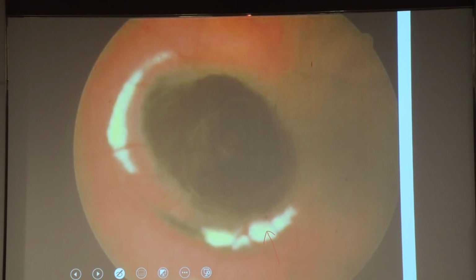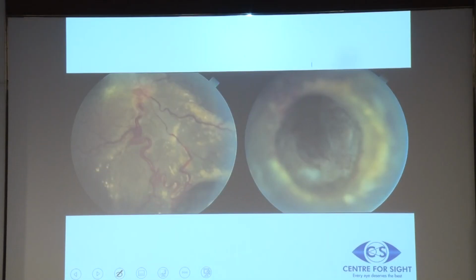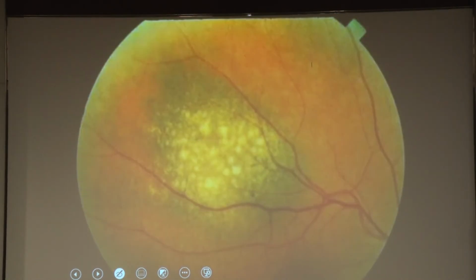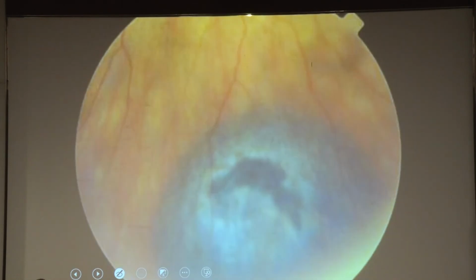Earlier, CHRPE was considered something that never grows, but actually it can grow, it can become an adenoma or even an adenocarcinoma. This was a very florid growth of CHRPE into a retinal pigment epithelial adenocarcinoma. These are rare tumors but can present. Of course, that's an optic nerve head melanocytoma. If you have a pigmented retinal or choroidal lesion, and there are a lot of drusen on top of it, that means that it is a chronic lesion.